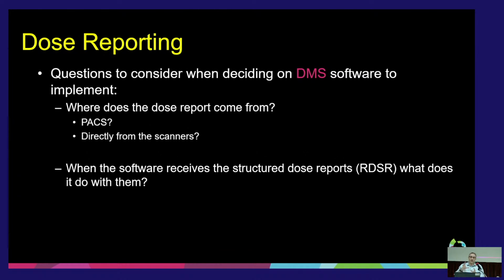And so some dose monitoring softwares cannot accept just the image dose report, the DICOM dose report, because they don't have the OCR, the optical character recognition software, to read it. And so they only accept RDSR. That means that certain dose monitoring softwares will only accept newer scanners.